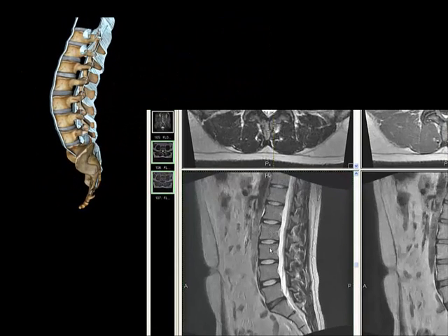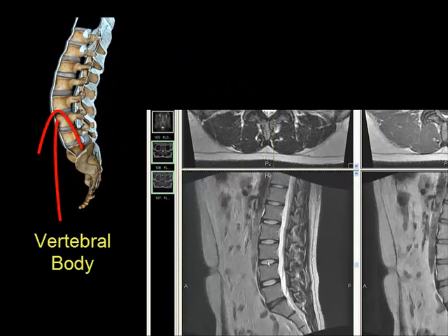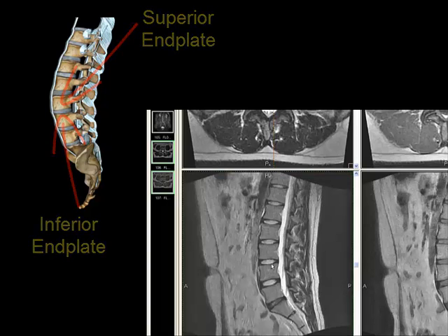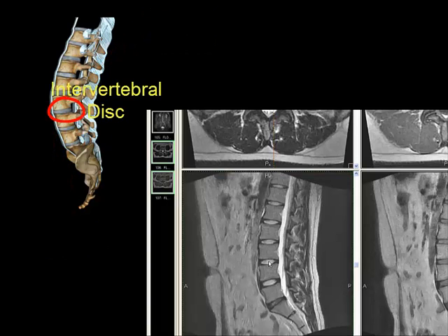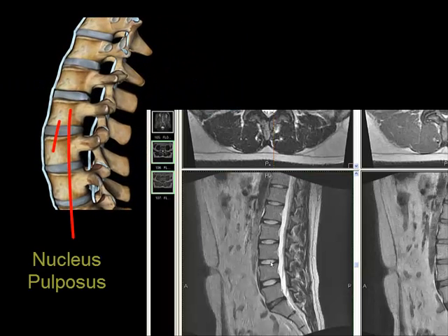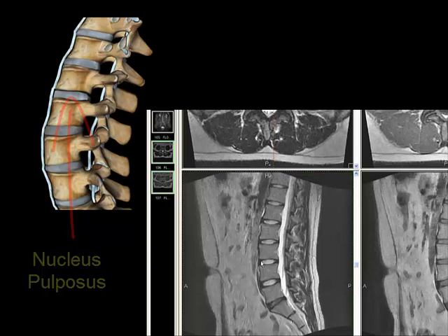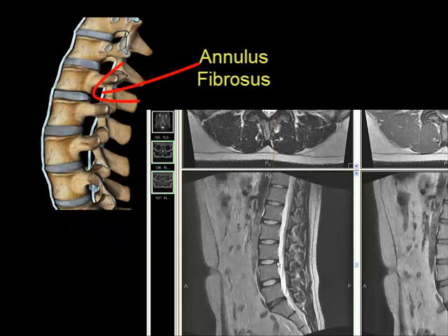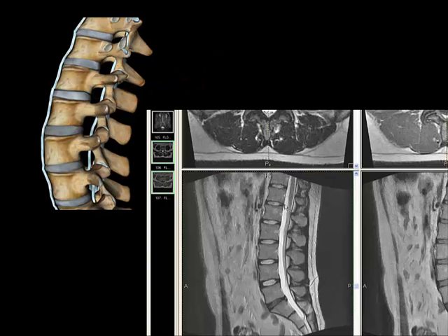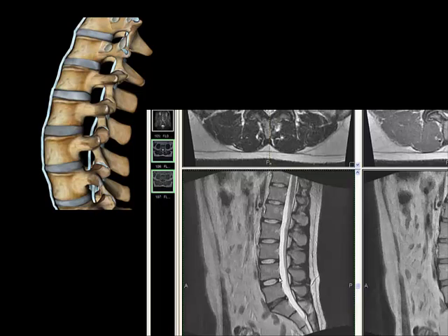This is a vertebral body here, here, and here. This is an inferior end plate here and a superior end plate here, and in between is the intervertebral disc. The bright, or hyper-intense part in the middle is the nucleus pulposus, and the dark, or hypo-intense periphery is the annulus fibrosus. The annulus fibrosus should be nice and flat with the back edge of the bone, and if that's the case, it's just going to be a nice flat line all the way down the spine.